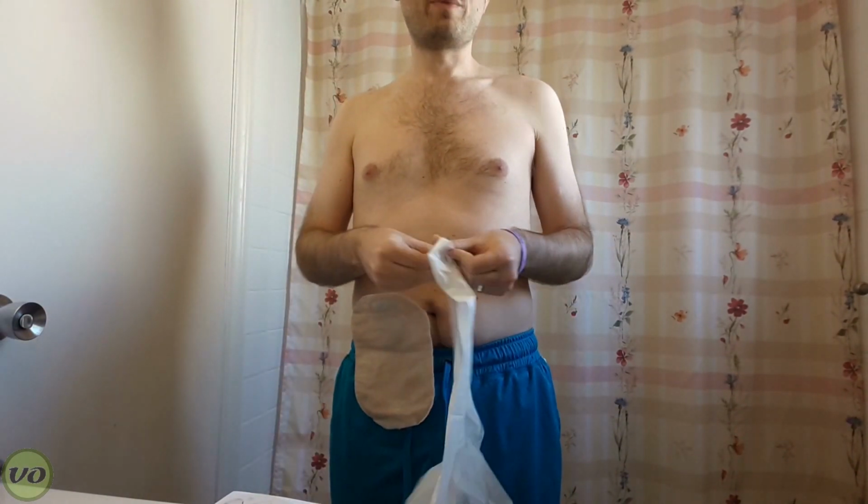Now, one tip that I do want to mention that I think a lot of people don't realize, use a baggie when you're changing your appliance. And what I mean by that is just hang it off your belt or your pants, and I'll show you what happens here.